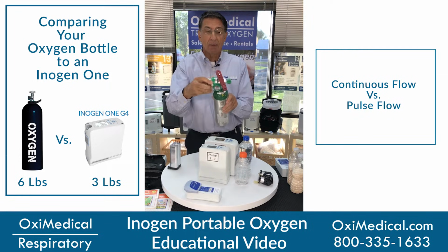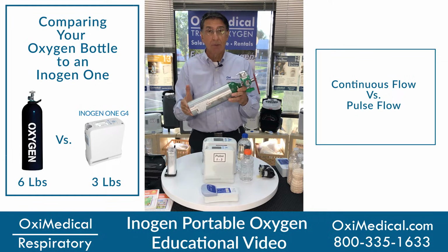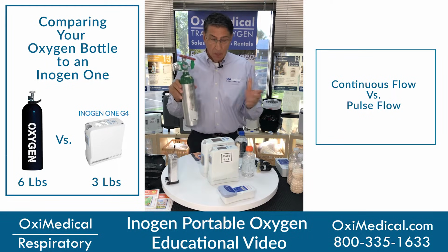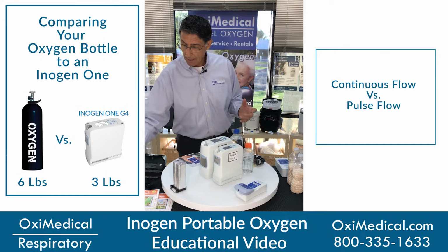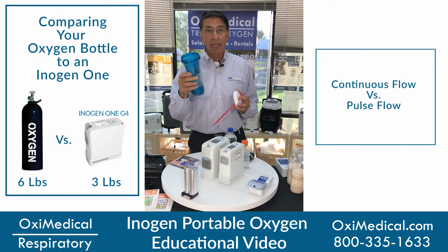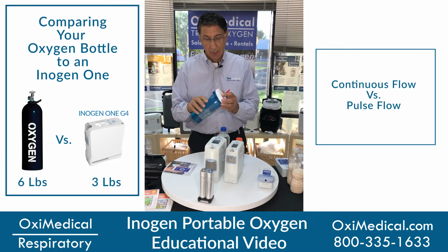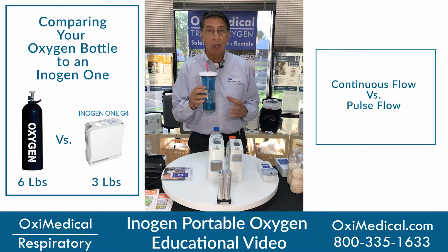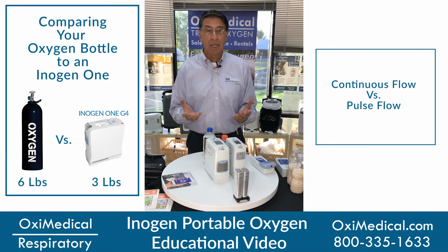And you're going to get a conserving device on top, so this tank will last you about 4.5 hours. It all depends what setting you place it on. What's the difference between pulse flow and continuous flow? Imagine drinking 2 liters in 1 minute. Pretty hard to do. So a conserving device is like sipping out of a straw, and you'll be able to sip enough oxygen to maintain an oxygen level above 90%.